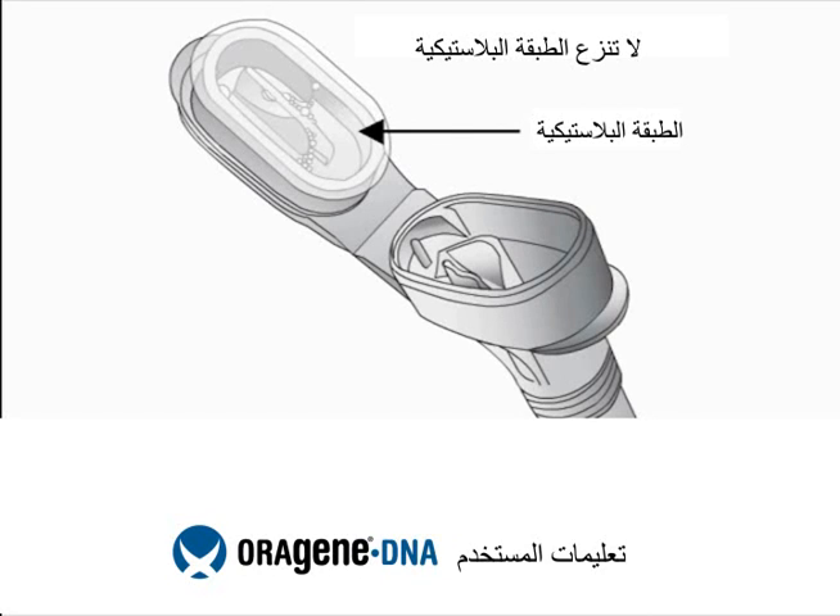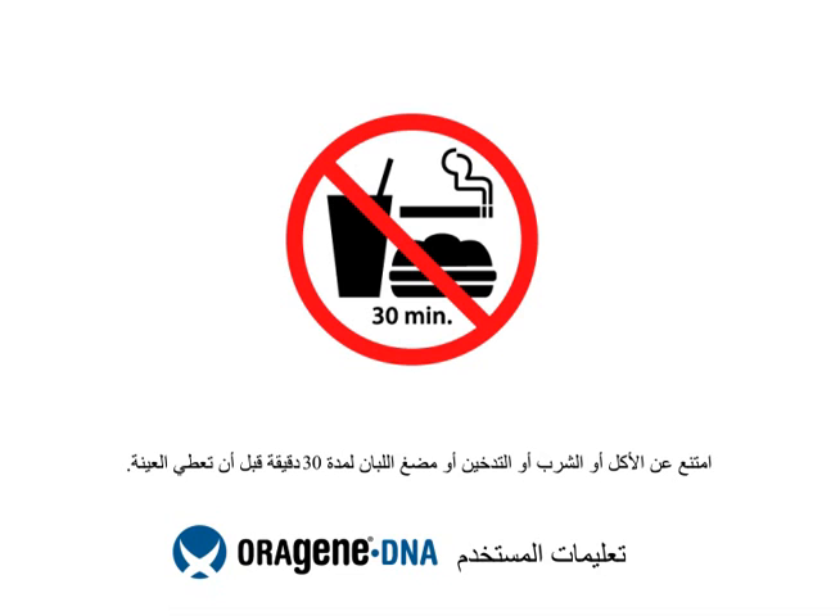Do not remove the plastic film. Do not eat, drink, smoke, or chew gum for 30 minutes before giving your sample.